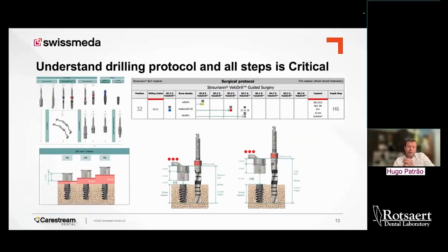So moving forward to another part of guided surgery, one thing that I would like to demystify here is that guided surgery is not simpler than freehand, okay? Why am I saying that? Because as you can see on these slides, with the normal guide, if you have an implant that is 8 millimeters, you get an 8 millimeter drill and you drill it. So there is nothing more simple than that. And when you have a guided surgery kit, yes, you have metal sleeves, you have longer drills, you have many more components involved, you have keys. But you know what? That is not difficult to learn.